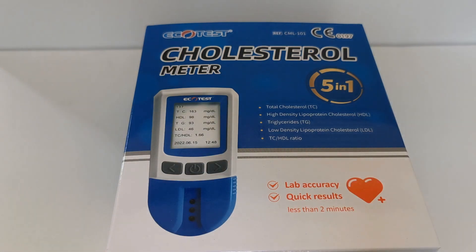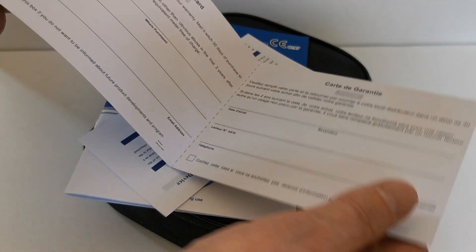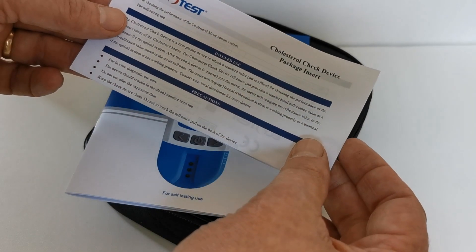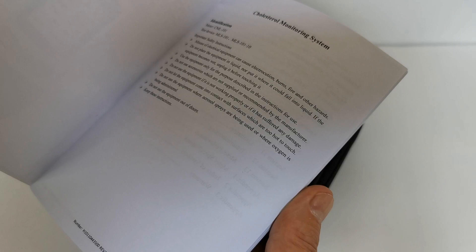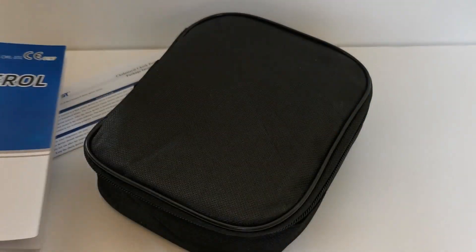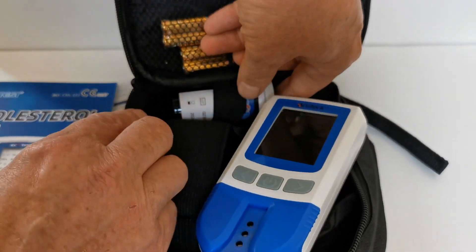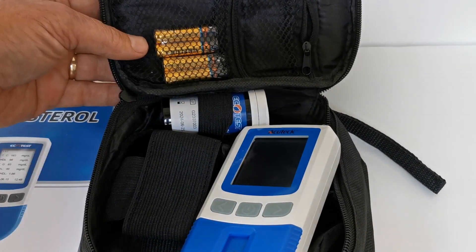Let's crack this meter open and show you what you get in the box. Out of the box, you get a mail warranty card — there's no need to do that if you've purchased online, as we've got a record of the purchase date for you. You get a cholesterol check device pack insert, a comprehensive set of instructions in English on setting up your meter and interpreting your blood cholesterol results. And inside the zip pouch, you get your digital meter, two check device cholesterol devices, and four batteries.